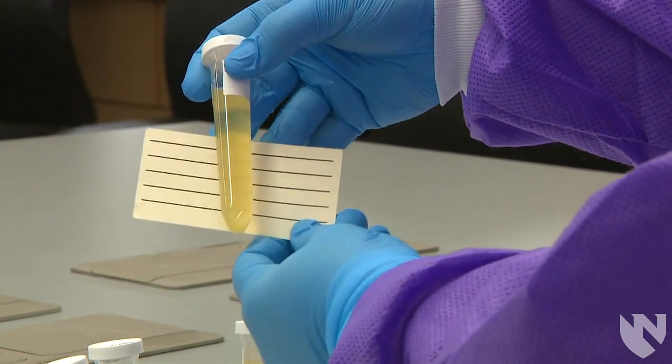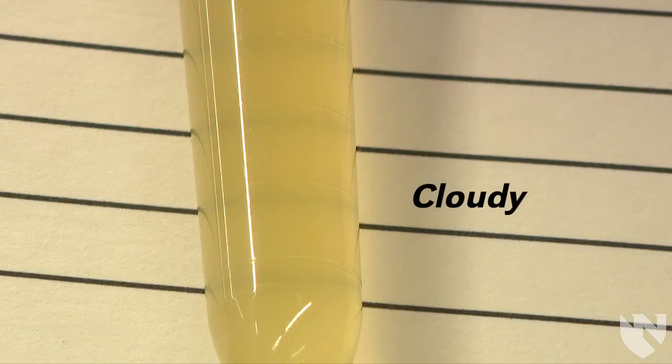Next, we have a cloudy urine. If there are visible dense particles and the lines become blurred or not visible at all, we report this as cloudy.